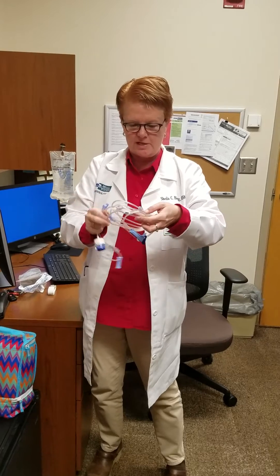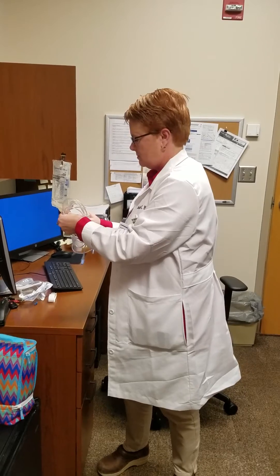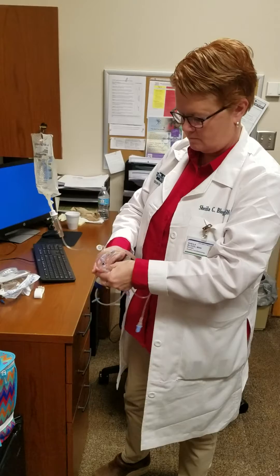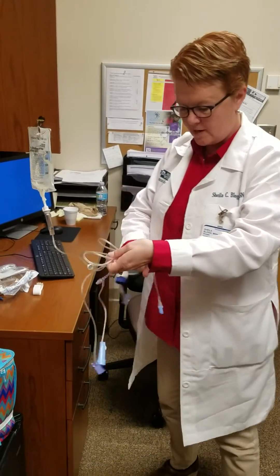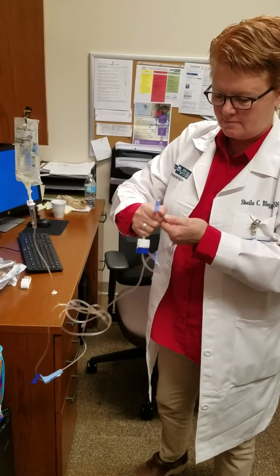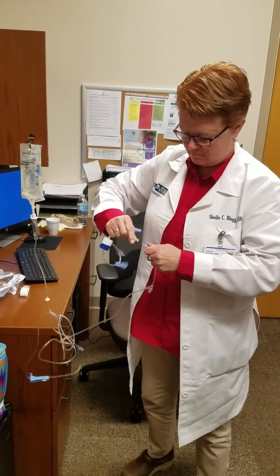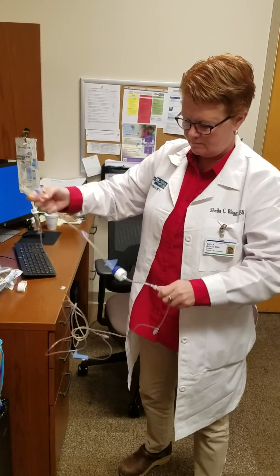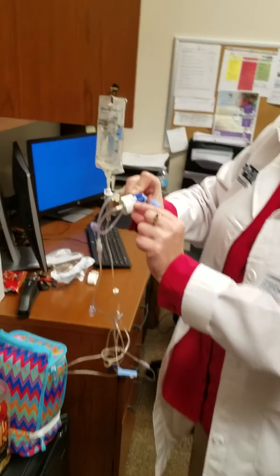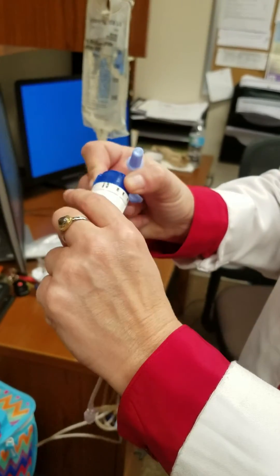So essentially this will be plugged into your fluid. You'll prime the tubing all the way to the end. There's only one connection on the dial-of-flow. On the side of the dial-of-flow is a prime — you're going to prime your fluid through, and then there are markings for the rate.